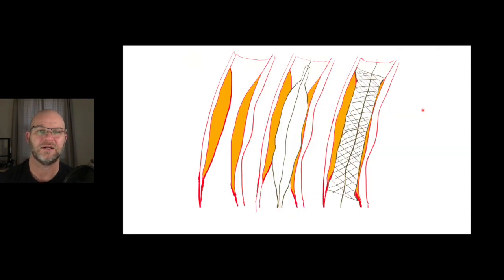If we find a block that needs fixed, it has to be greater than 70% to require a stent. So here we have our artery, we have the plaque on the inside, and this would not be a STEMI. Remember, if this ruptured and what's inside the plaque is revealed, the body thinks it's bleeding to death and sends platelets and clot to that area. But if we just have an 80% blockage in here that's causing our problems, then you can go in and blow a balloon up.